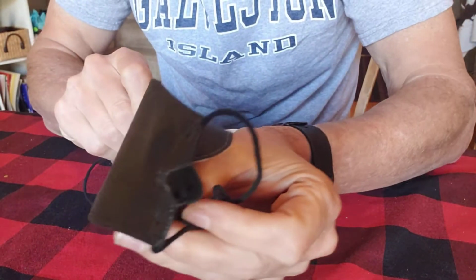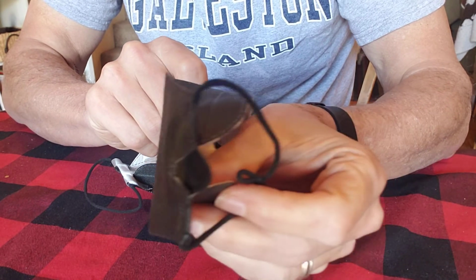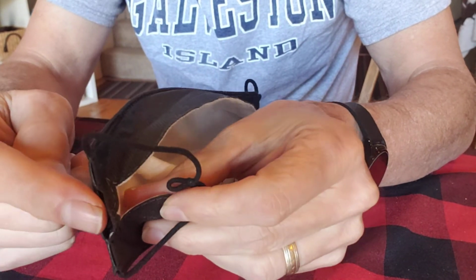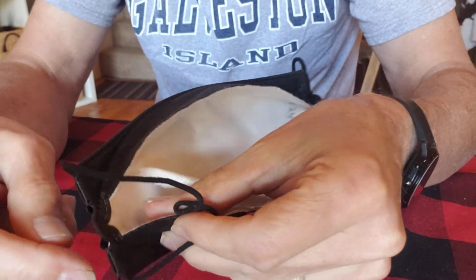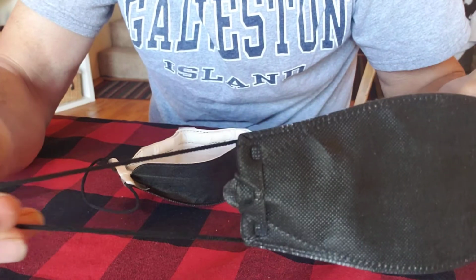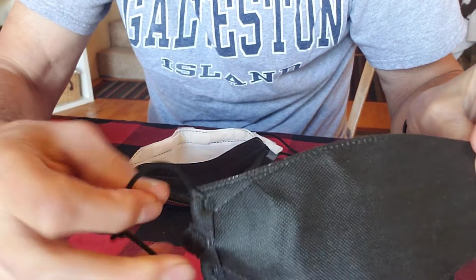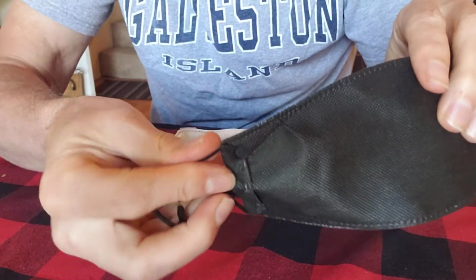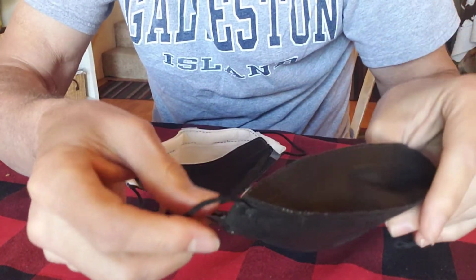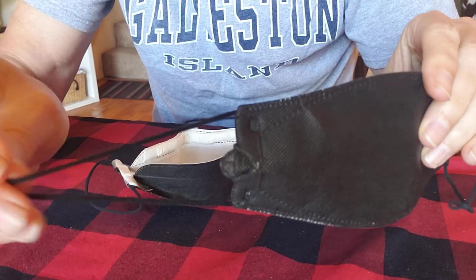I'm not sure if you can see it, but it distorted the mask. Yeah, like this little bump right here and this little bump right here. So when you're pulling on the mask, with the way I've tightened it, pulling outside here tends to pull everything together and it distorts this. So I kind of created this problem by tying the knot.